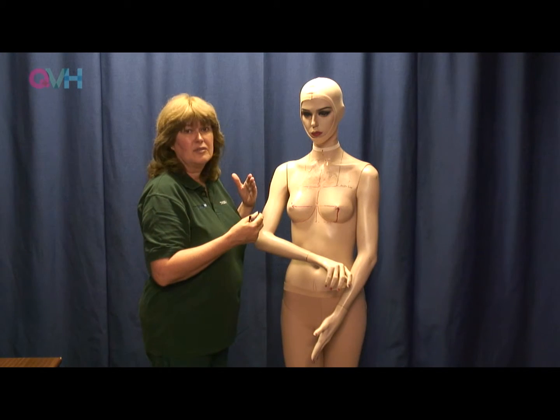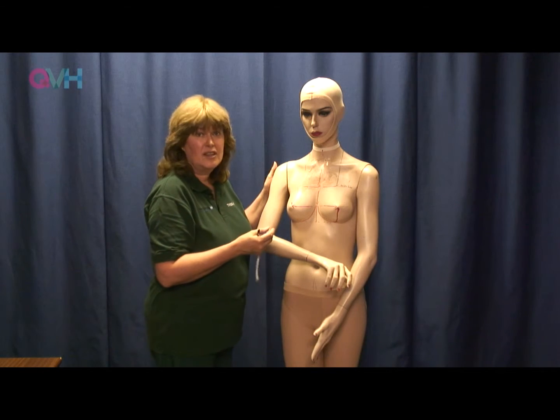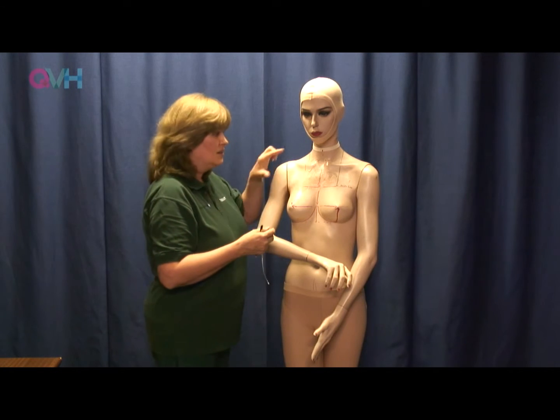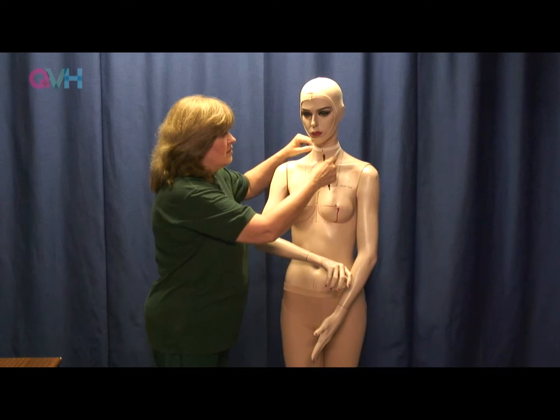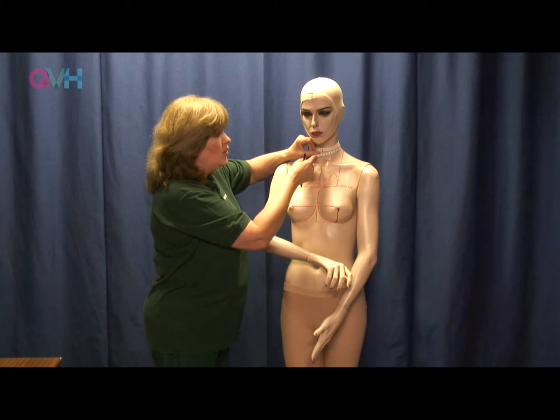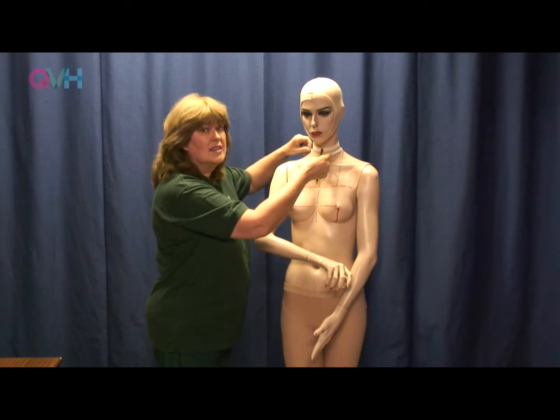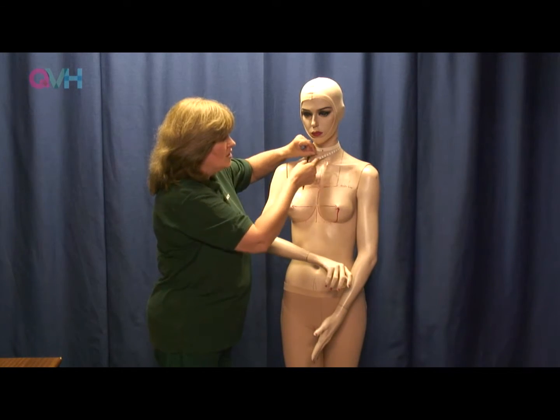So if possible, and to make it as short as possible for a patient, have them stand, because if they're injured they do find it difficult, but then you're able to get a better measurement. The first measurement would be around the neck, and generally try to place the tape measure where you're able to read it easily, so you're not dragging the tape measure on the skin.